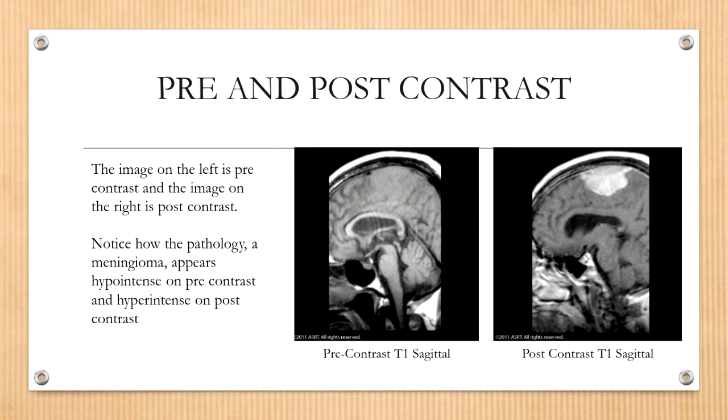In your X-ray programs, whenever you graduated from X-ray school, I'm sure that image evaluation was one of the bigger things of completing your requirements. In MRI, it's the same, except that since you're a technologist, it comes to you naturally because you've been trained to do it. But try to take a step back when you're looking at MR images and try to outline and differentiate between the different things that are noticeable on the images that you're evaluating.